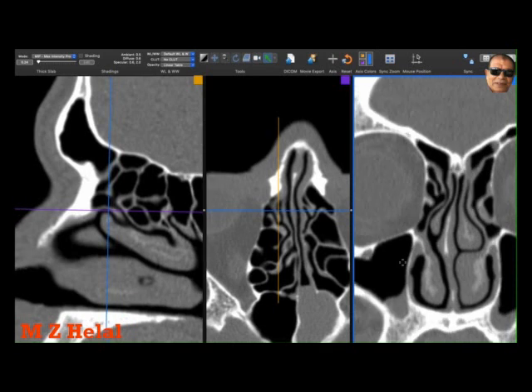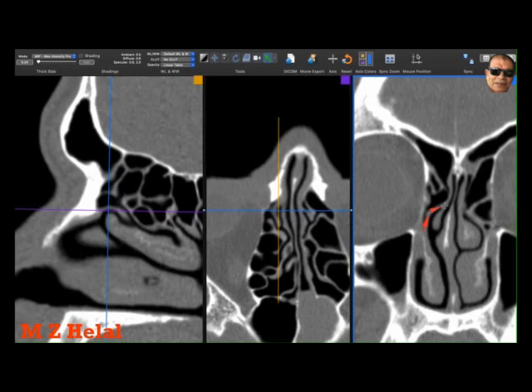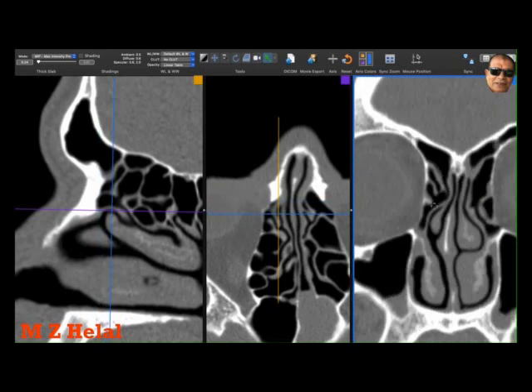This is the commonest insertion of the uncinate, but in this patient he has also another attachment here to the middle turbinate. So it is not uncommon to find the uncinate attaching laterally to the lamina papyracea and at the same time also having some attachment with the middle turbinate.